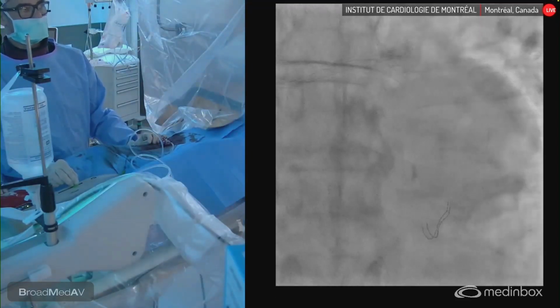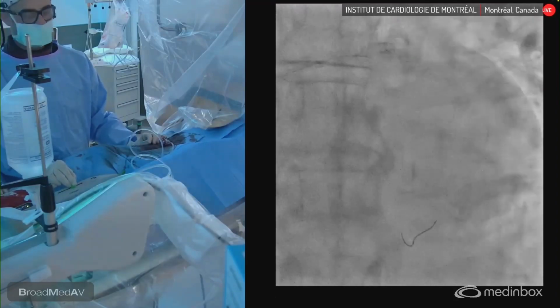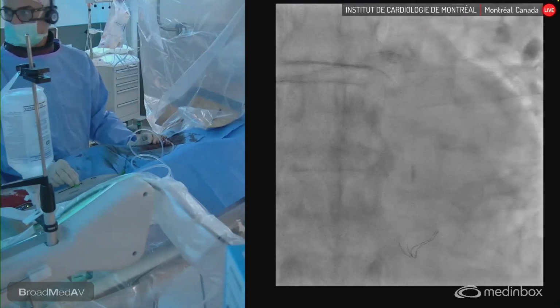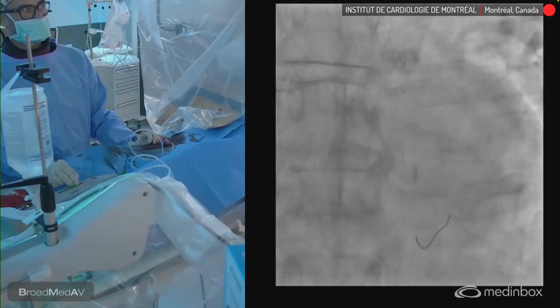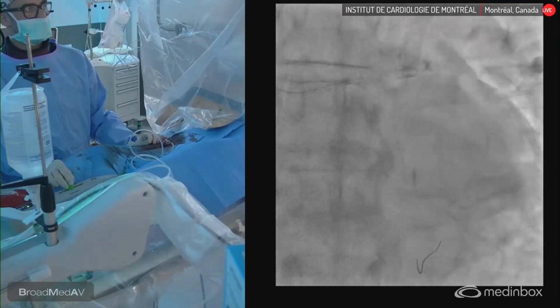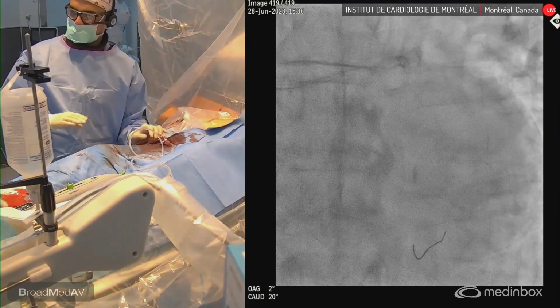So you listen to the tonal changes. And you want to go very slowly, polish the vessel. Compared to the Rota where you do pecking movement. So you hear that the sound is not the same. So it's polishing the vessel in the mid portion and in the proximal portion. And you can go back for it also in front. And you can also polish.